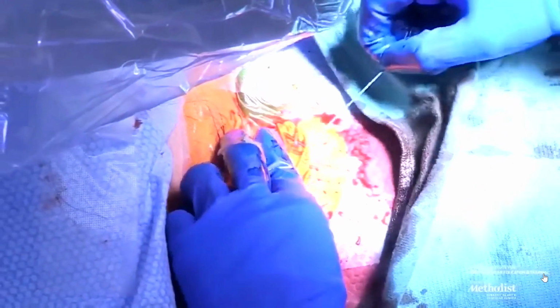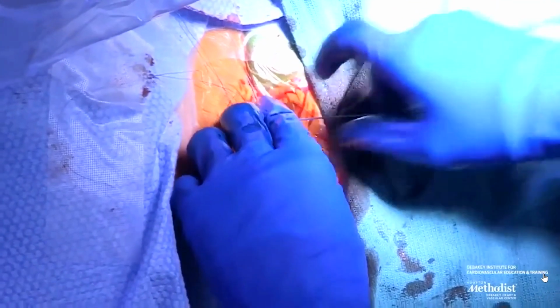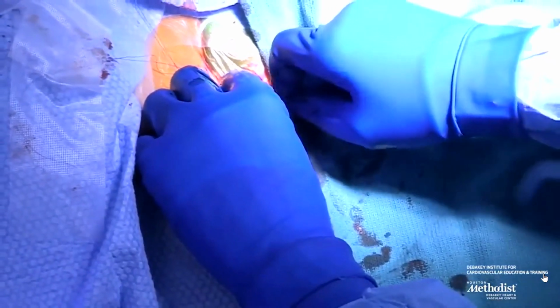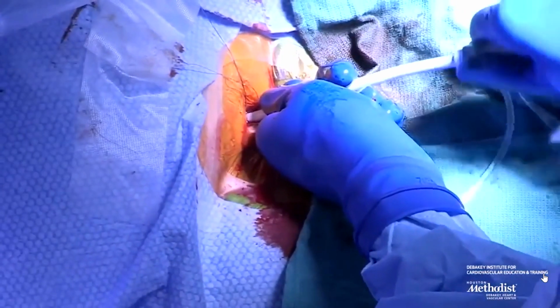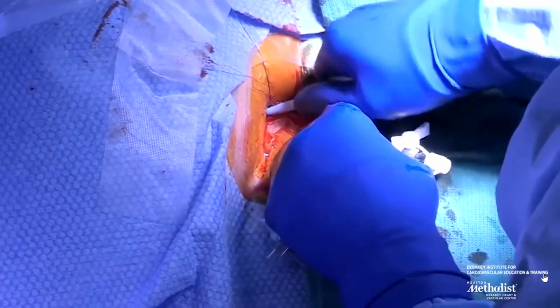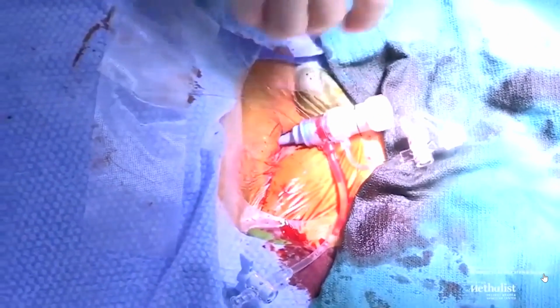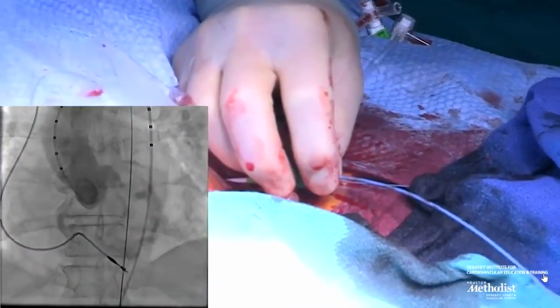And we can exchange that J wire, which is usually a softer wire, for this, which is an Amplatz super stiff wire. We use the Amplatz super stiff because it's harder to kink the wire as you're putting in the sheaths, and so it's harder to make a vascular injury. That is our 18 French sheath through which the valve is going to be placed and deployed. You can see a little bit of wiggle motion, but there should be very minimal resistance. You put the sheath all the way into the vessel, and it goes past the bifurcation. You secure it, and then you retrieve the wire.